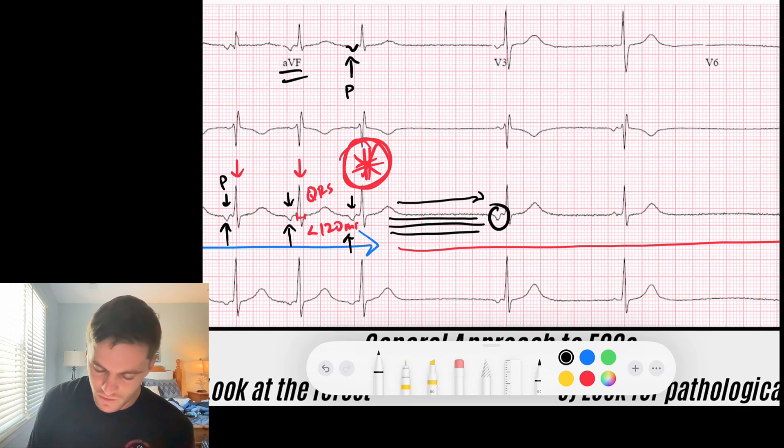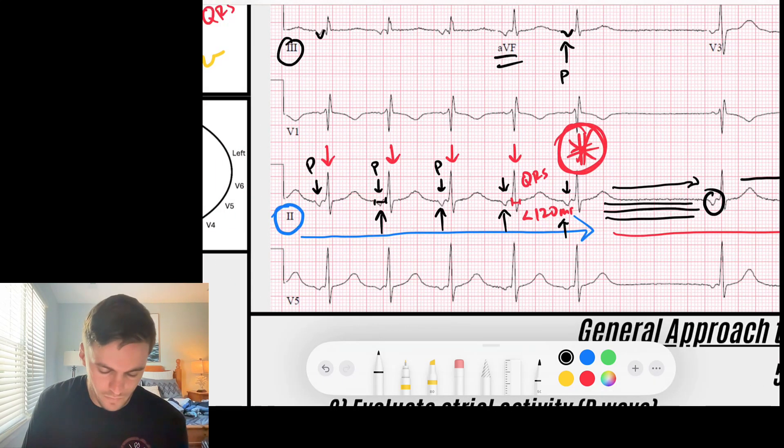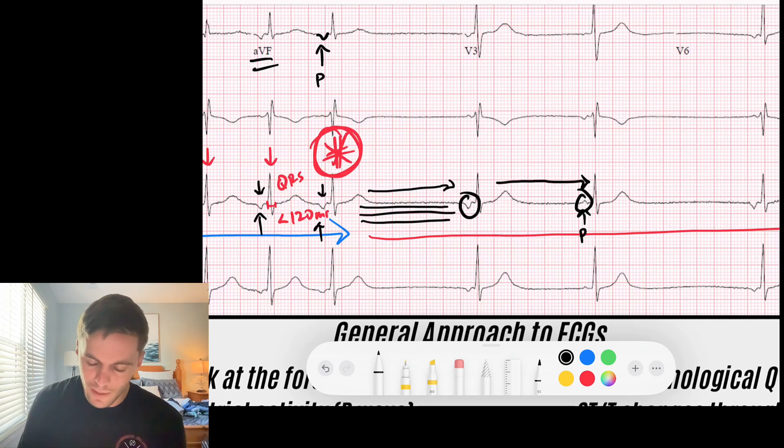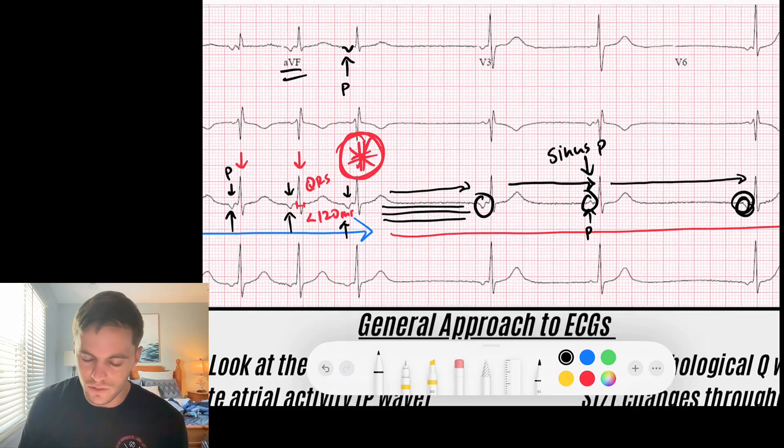Then look, we get another ectopic beat. We get a long pause, and it actually seems like this P wave looks a little bit different than a normal P wave. It might actually be a sinus P wave, because this is lead two and this P wave is upright, so we might actually have a sinus P wave.